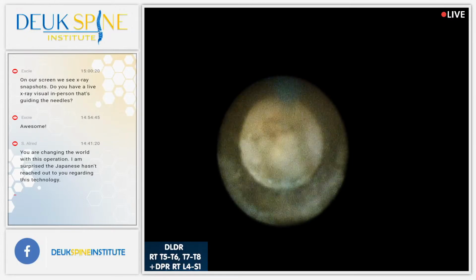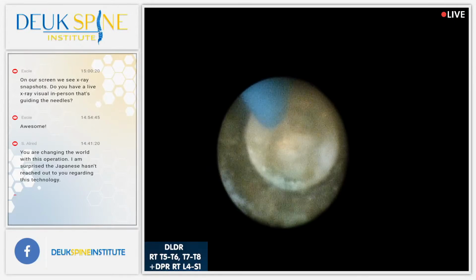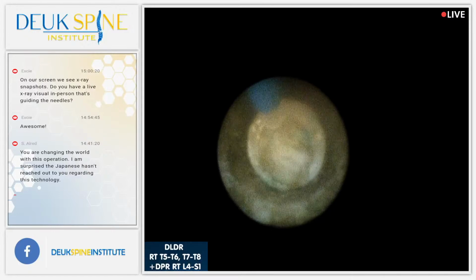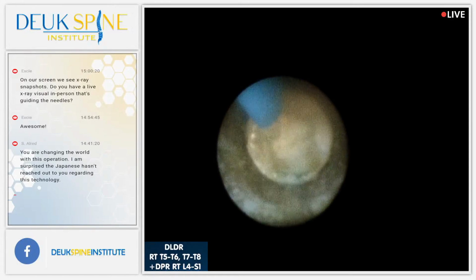By the way, you can see the healthy nucleus down below. We don't talk much about it, but see how white it is? That nucleus down there is pretty darn healthy. It looks good to me. I don't think that's scar tissue. I think it's nucleus. And it's the blue stuff that's degenerated. It's the blue stuff we want to get out. Leave the white stuff alone. Okay?